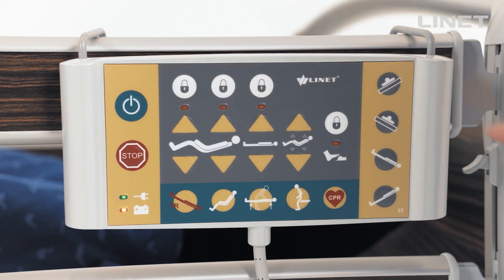On the right, there is a lateral tilt left and right, gray Trendelenburg, and reverse Trendelenburg.